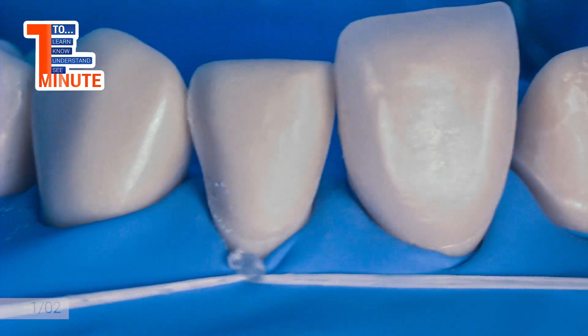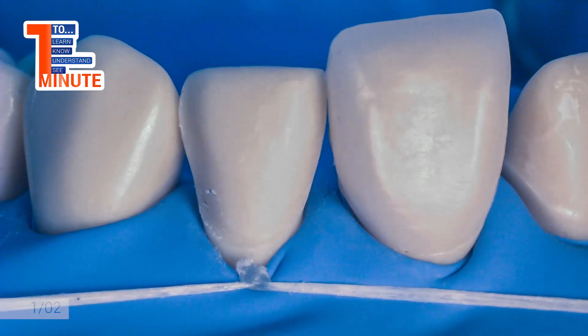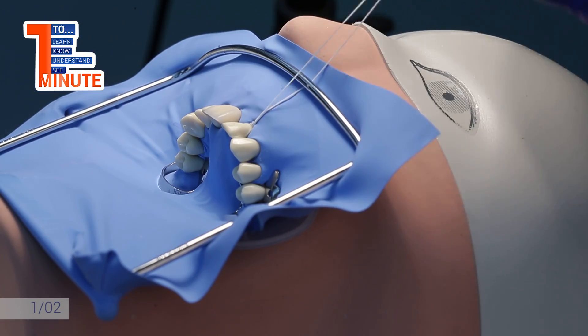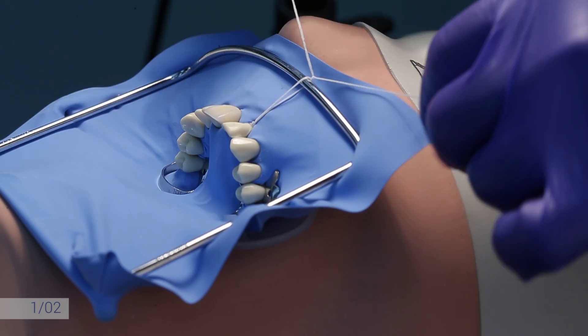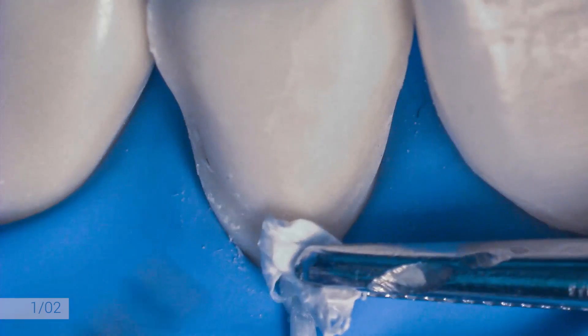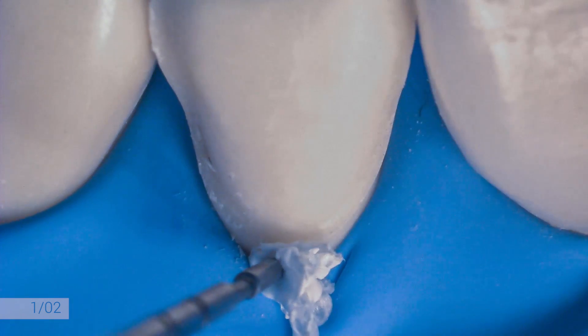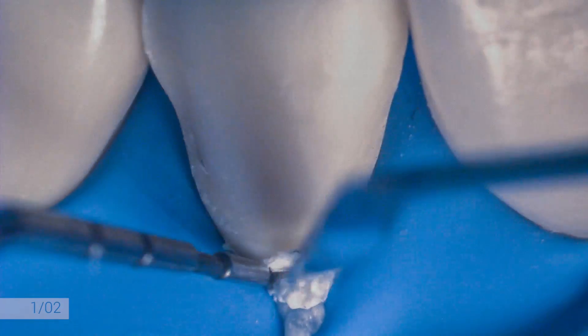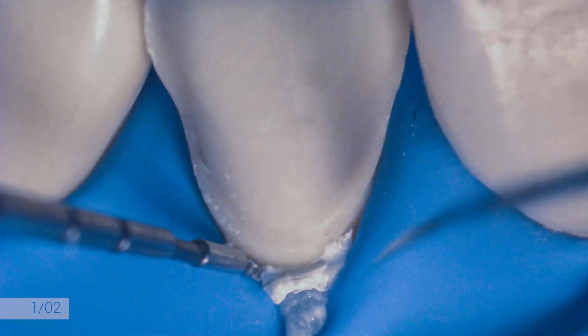To obtain more retraction, the free floss parts must be pulled and tightened to the frame. One more tip: to get more space, a small piece of teflon can be placed and packed between the floss tie and the tooth. Ideal isolation is obtained, sometimes even without clamps.